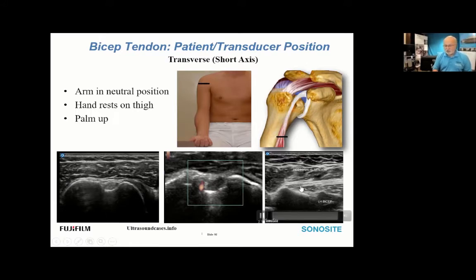Adjacent to the bicep tendon is a small arterial structure to be aware of when advancing a needle. If advancing toward the posterolateral aspect of the tendon to deliver injectate, be aware of the location of this small artery. Scan the bicep tendon from its proximal location distally to the myotendinous junction, which is at the same level where we encounter the pectoralis tendon inserting onto the humerus.